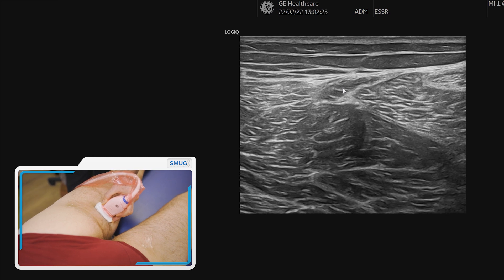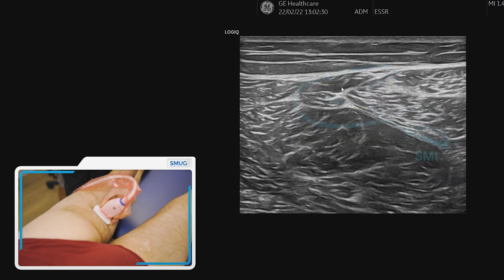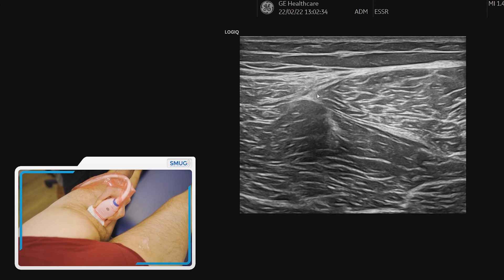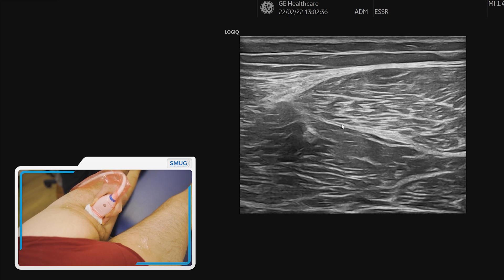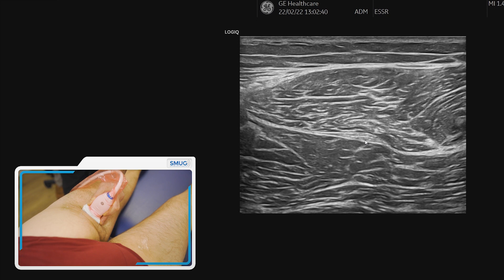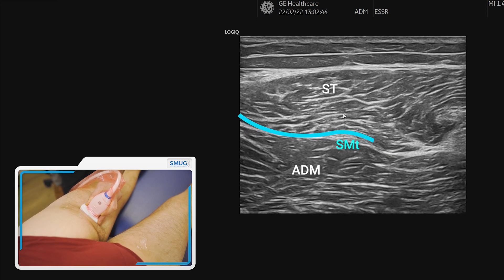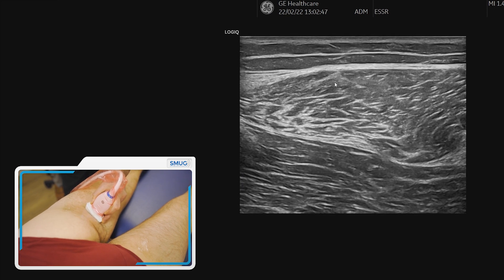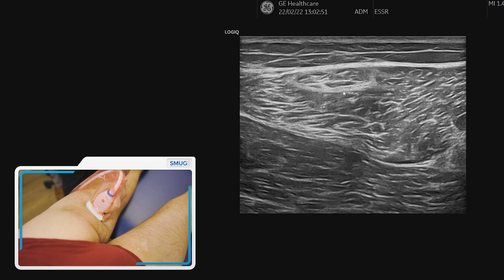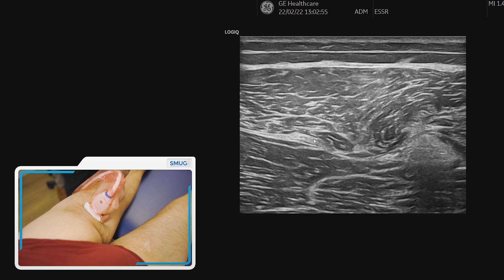If we get to the fascial plane at the medial side and go distally, you can see the muscle of the semimembranosus coming up. Going back, it disappears again. Following the deep fascial plane a little bit more lateral, you can see this nodule which is the semimembranosus tendon — above that is the semimembranosus muscle, identifiable distally by the strata that goes through it.